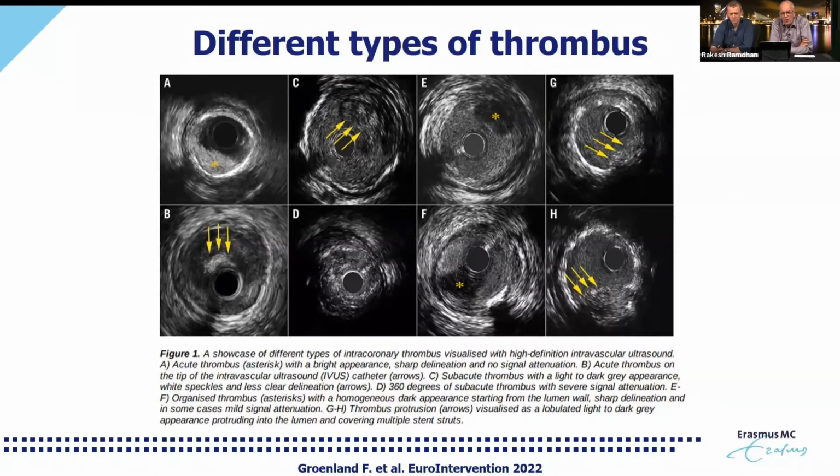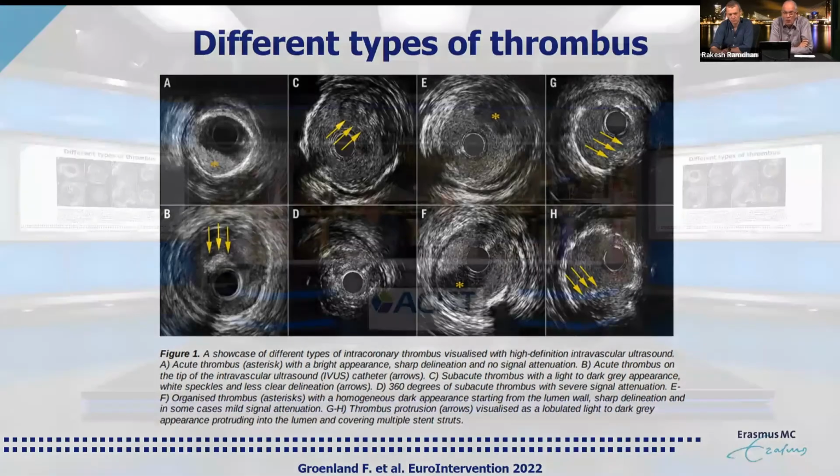Yes, because thrombus is a story apart, because thrombus is not plaque like I explained before. Thrombus is formed in the blood, and it's, as you know, a whole process. And what we found in this process, and that took some time, is that we can recognize three different stages of thrombus: the acute thrombus, as you mentioned, then the subacute thrombus, and if I tell you the lines of Zahn in histology, then you will recognize that it's a subacute thrombus, a sort of in-between stage.